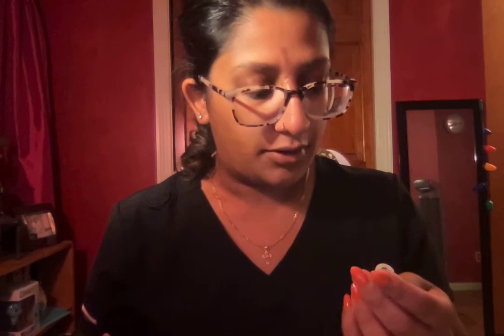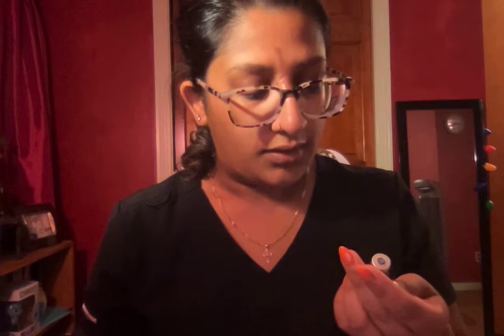vial for the haloperidol. And I noticed that the vial is a multi-use vial. It is a 5 mg per ml vial, so it's a multi-use. So we only need 2 mg IM for the haloperidol. So with the calculations, the medication that needs to be administered is only 0.4 ml. So I'm going to draw up 0.4 ml on here.